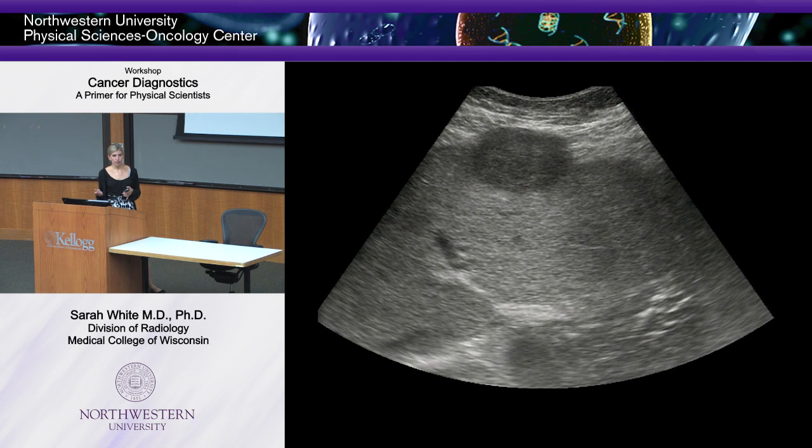So this is the liver, okay? When you're doing the kidney it sits right by the liver, so they kind of put the probe and they're like, whoa, what's that? And they get this. The problem is when you drink 10 beers a day for 40 years, your liver becomes fibrotic and you get something called cirrhosis. And I'm sure you've all heard of cirrhosis.